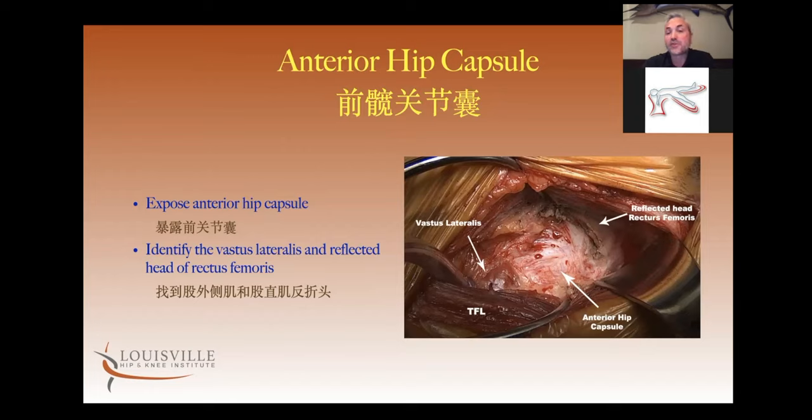Once you go through the vessels, you dissect through a fascia layer that sits over the precapsular fat, and then through the precapsular fat — now you're on to the capsule.